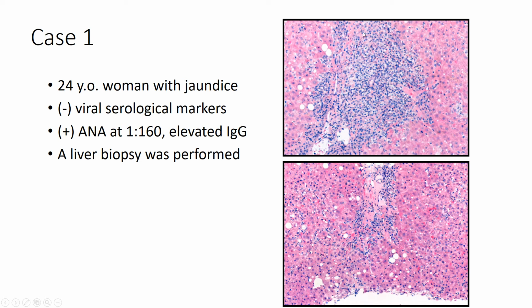This is a portal tract, quite different from the normal portal tract that I showed you earlier. Why? Because this is filled with inflammatory cells, specifically lymphocytes and plasma cells. And notice that the edge of this portal tract is way beyond the confines of that normal portal area that I showed you earlier. Not only because it's fibrotic, perhaps, but also there's spillage of inflammatory cells into the limiting plate and beyond. What is that called? That's interface hepatitis. So here, the entire circumference of this portal tract is eroded due to interface activity.